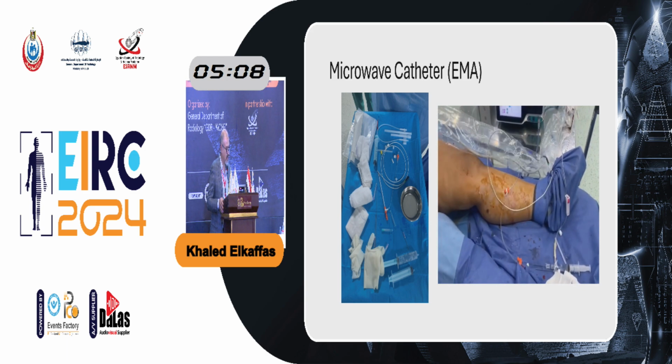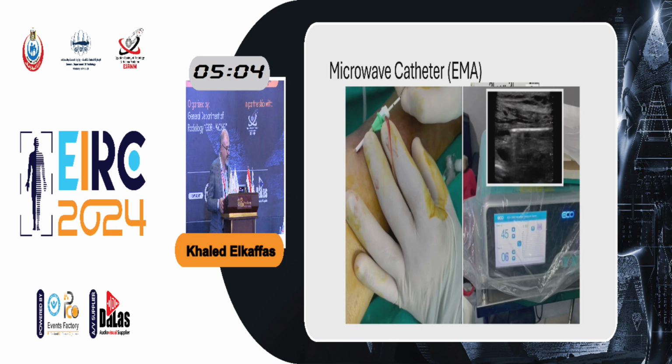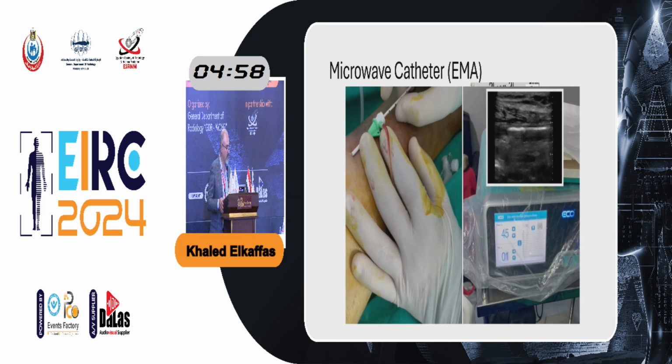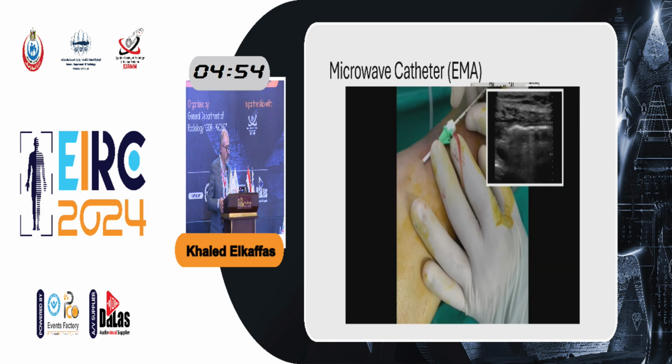After we introduce the catheter as usual, we start the ablation. You can see here the heating element of the microwave ablating 1 centimeter by 1 centimeter in a short interval, about 5 to 6 seconds. And here is the appearance of the ablation, also by steam, and there are no perforations.